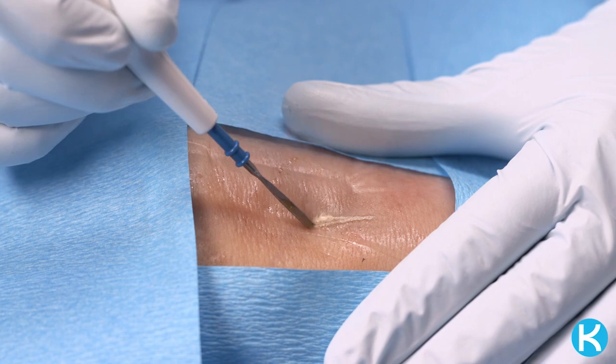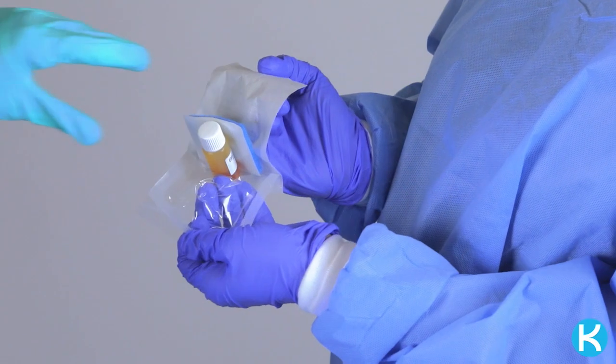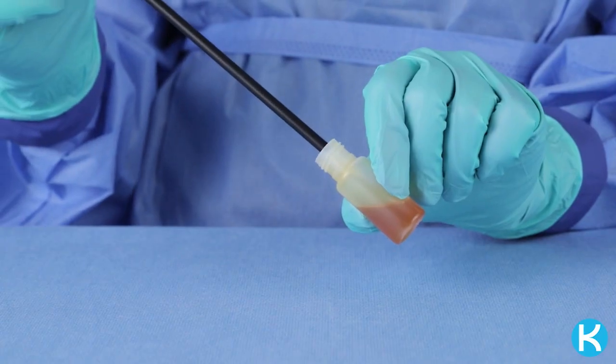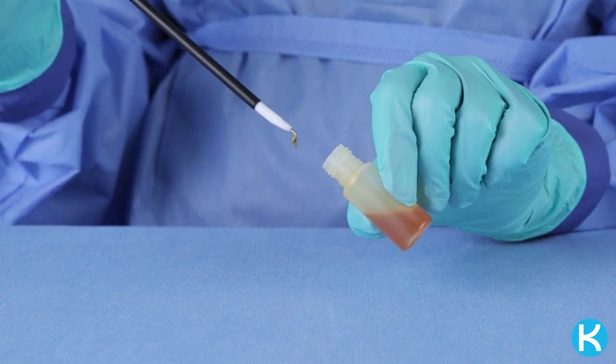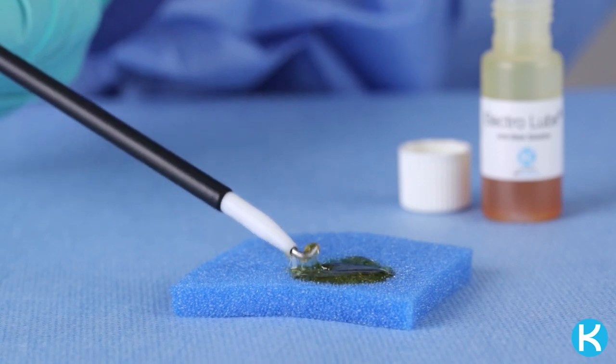Electrolube is a single patient-use device designed to reduce tissue sticking on electrode tips. To use, open the pouch contents onto the sterile field. Apply a thin film of Electrolube by either dipping the instrument directly into the bottle, avoiding the wrist, or by pouring it onto the foam pad and wiping the instrument tip.